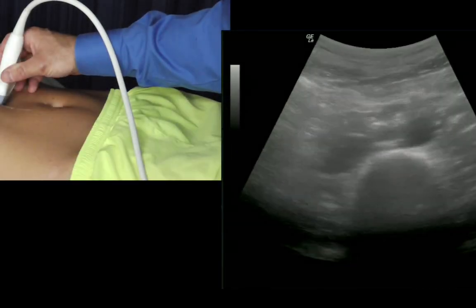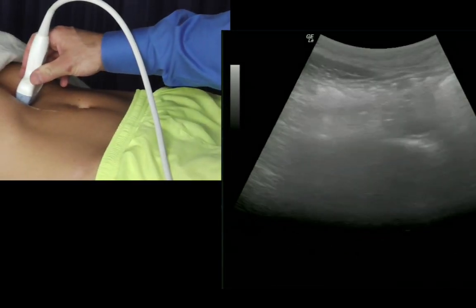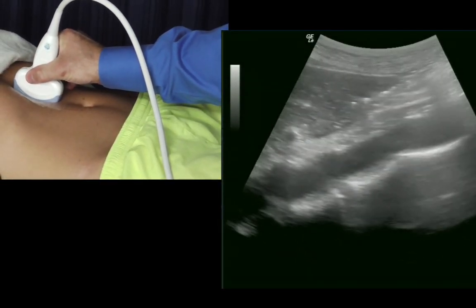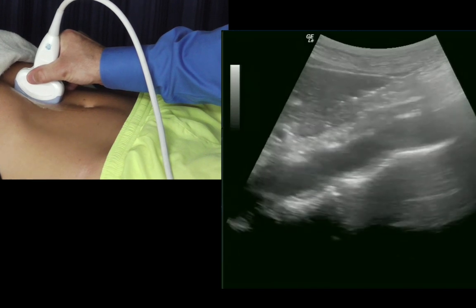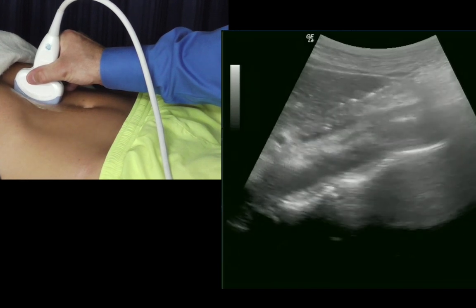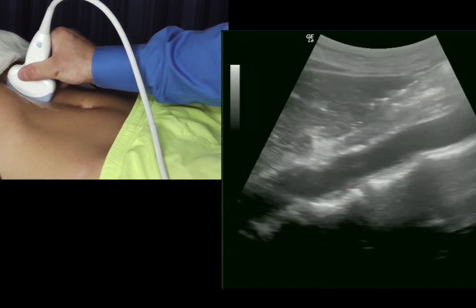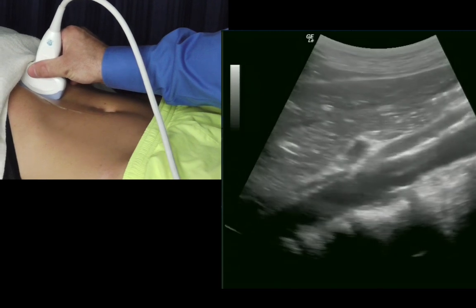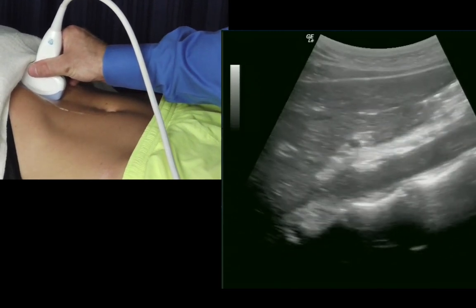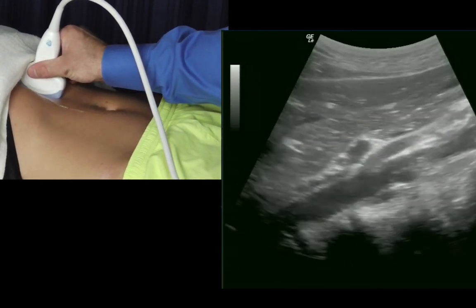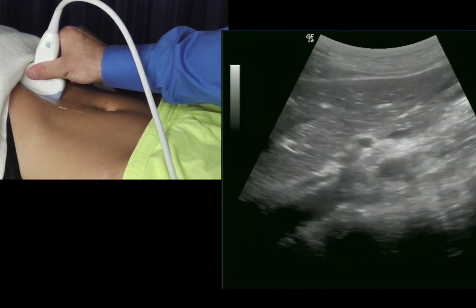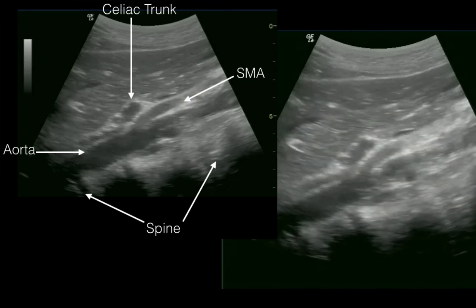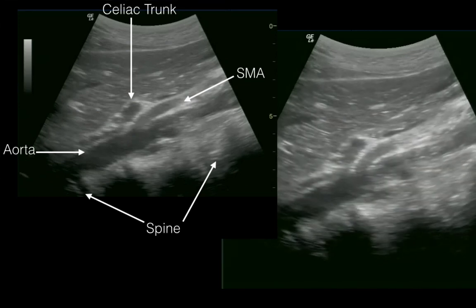To obtain the long axis of the aorta, turn your probe north-south on the body. Here we see the aorta in long axis with the spine posterior. We can slide up and down the aorta and see the branches we saw in short axis. One of the most important views here is to find the celiac trunk and the SMA takeoff. Here we can look for lymphadenopathy and other pathology.